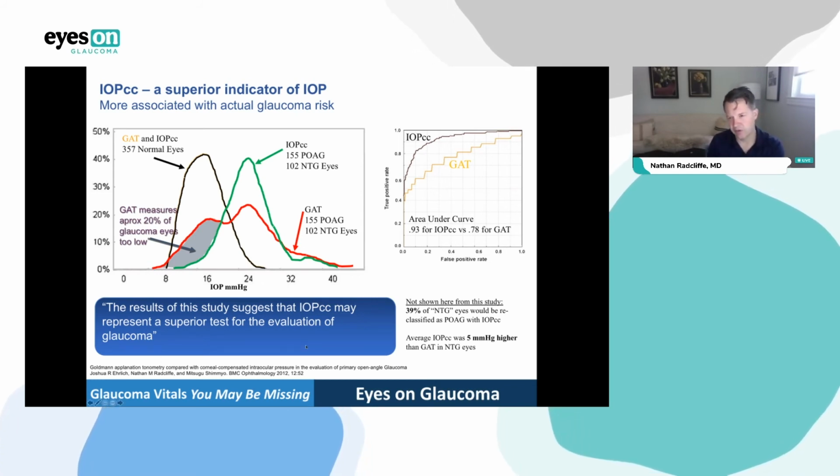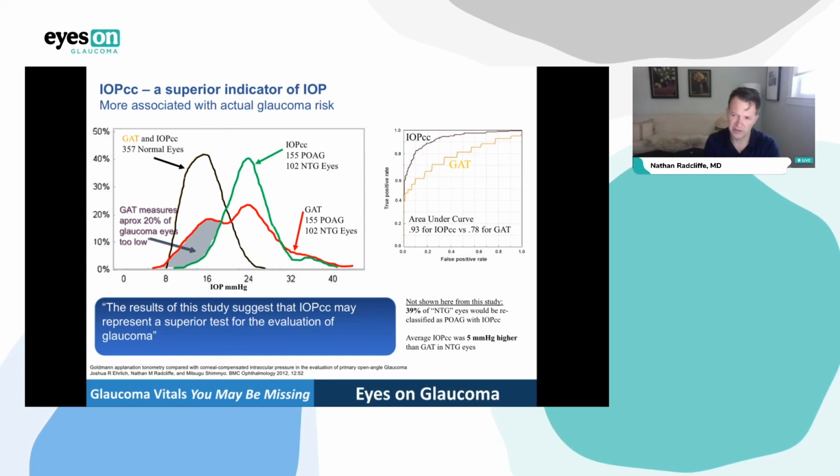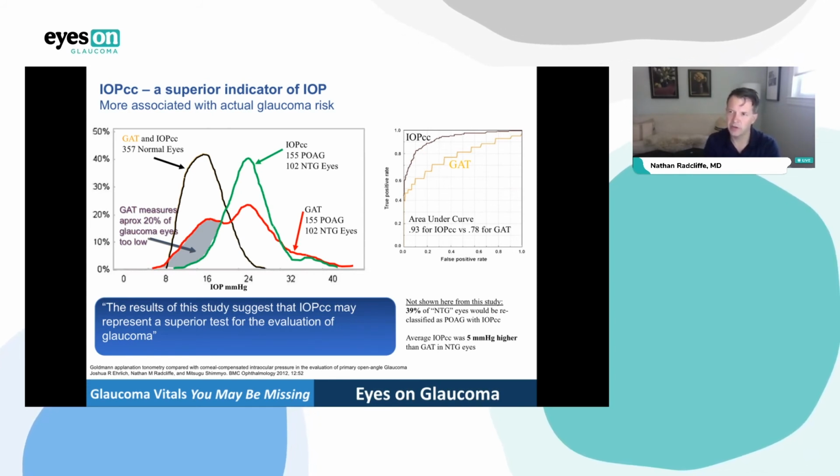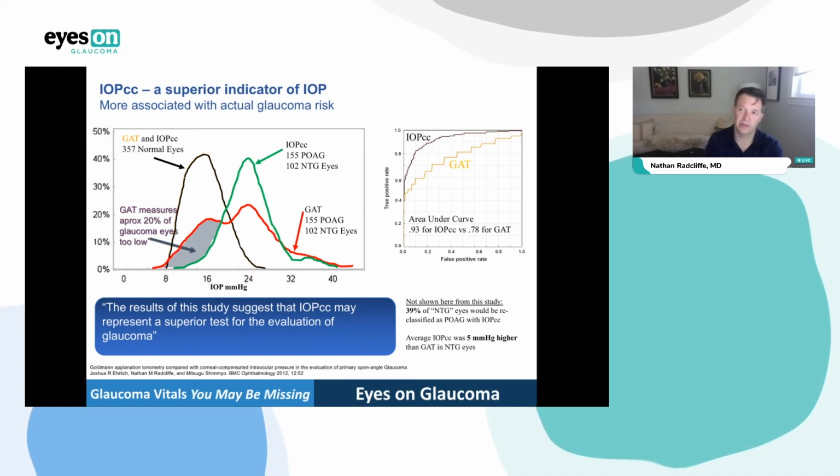So we sort of said in our paper here that you could use corneal compensated intraocular pressure and start to pay attention to pressure again, if you will, because we kind of ignore it when we know the corneal thickness or hysteresis is off. One thing I did want to get back to is that when someone's had corneal surgery, such as LASIK, you can't use their hysteresis anymore to judge their risk. You want to know their pre-op hysteresis, not after LASIK.